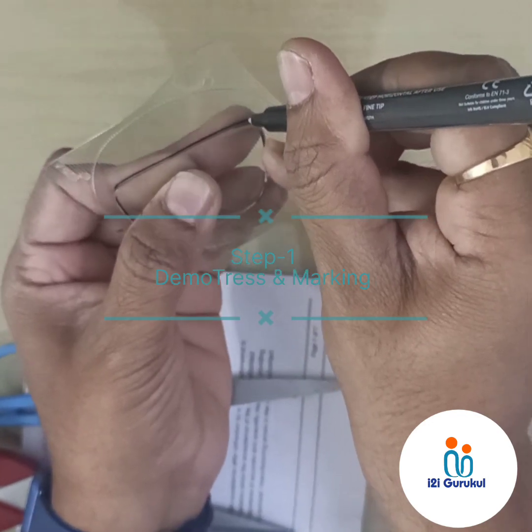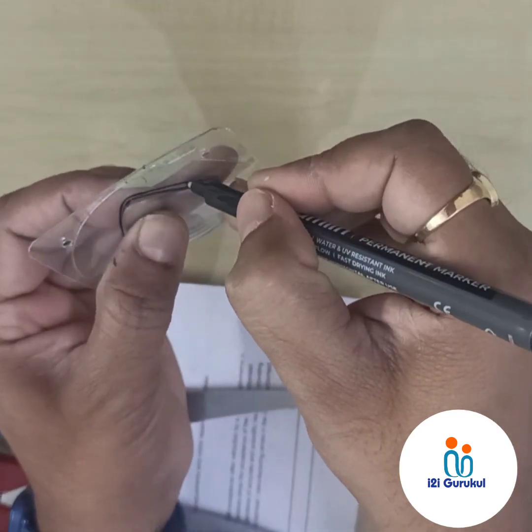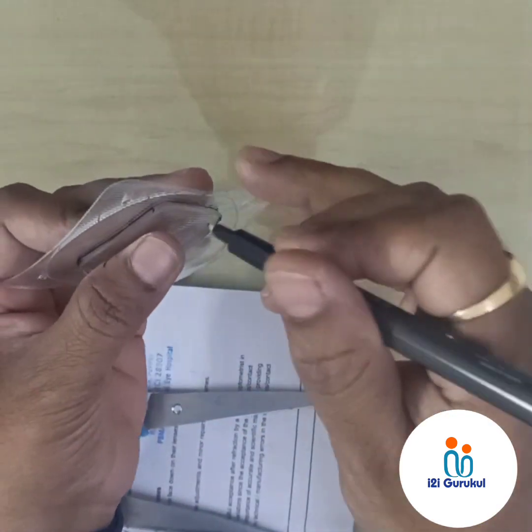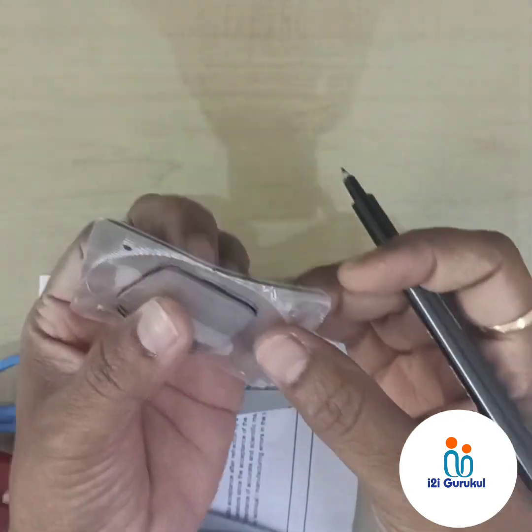For demonstration purposes, please use a glass marker and maintain your bevel angle of your spectacle lens, so that it will give you the exact shape on the Fresnel prism. This is your reference border of the lens.